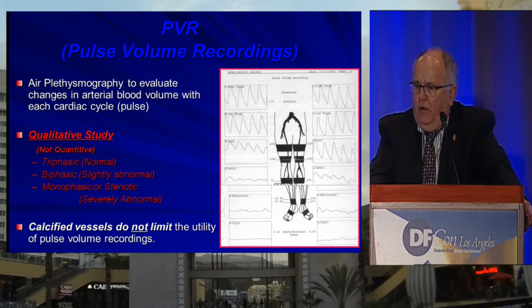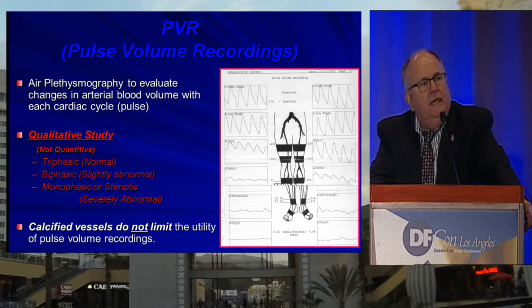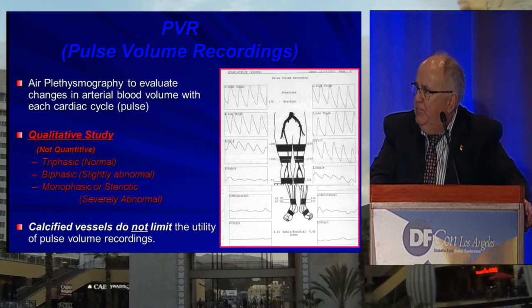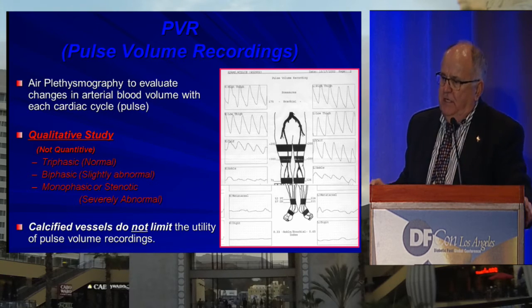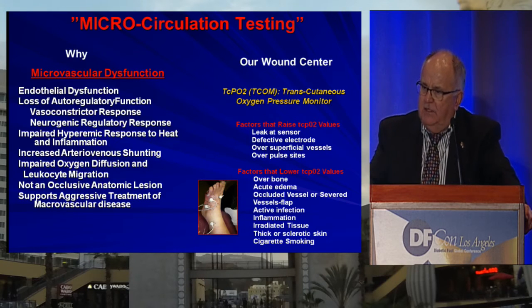Pulse volume recorders is a qualitative study. Calcified vessels do not limit their utility, and what you're looking at here is the volume of blood going through a segment of the leg at any one particular time in the cardiac cycle.